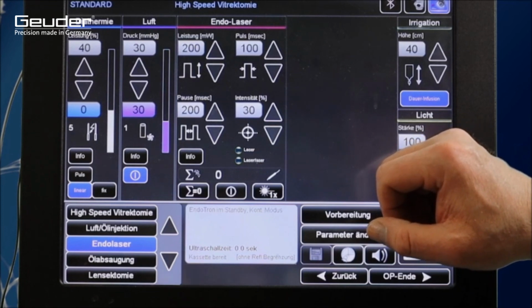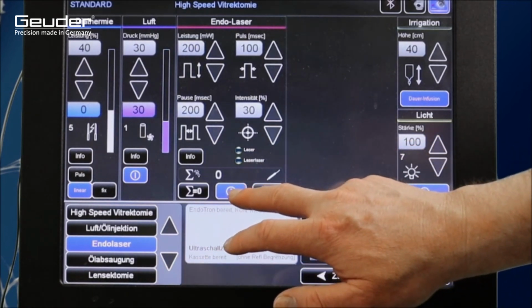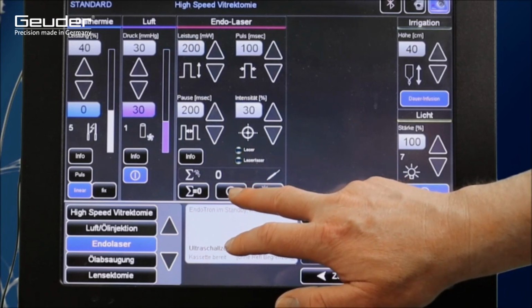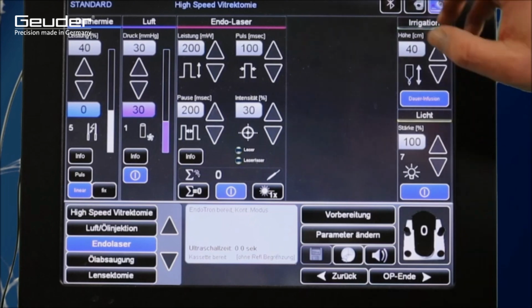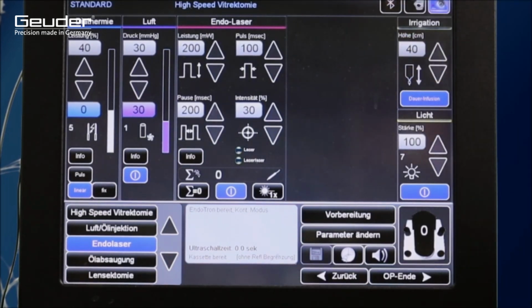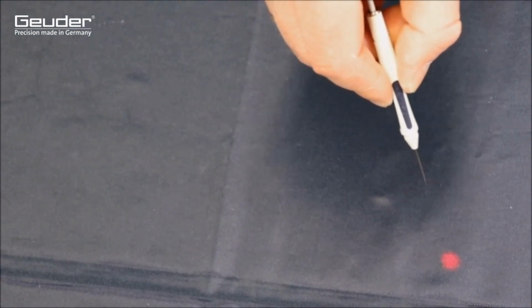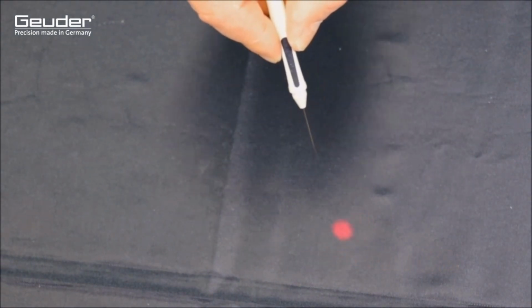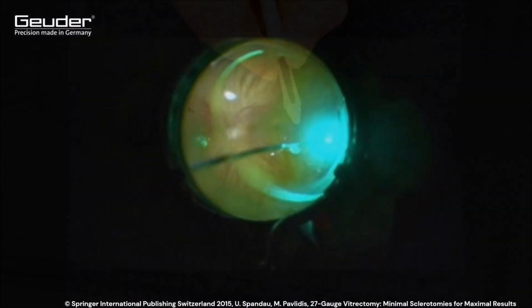For regulatory reasons, the foot switch must be equipped with a laser protection bracket if it is possible to control a laser device in order to prevent accidental triggering. If the laser device is activated or in standby mode, the so-called pilot beam can be seen, which is harmless to the human eye due to its wavelength. It serves to localize the area of the subsequent laser beam application.